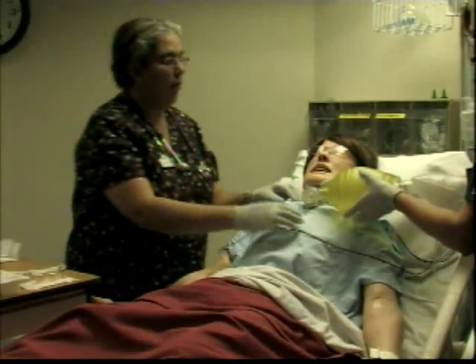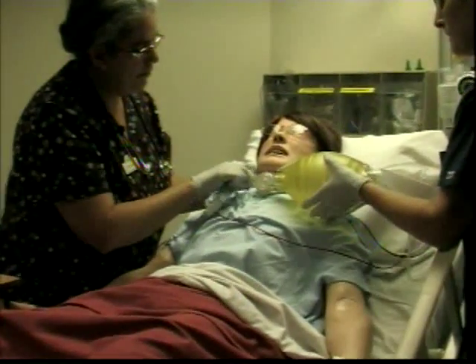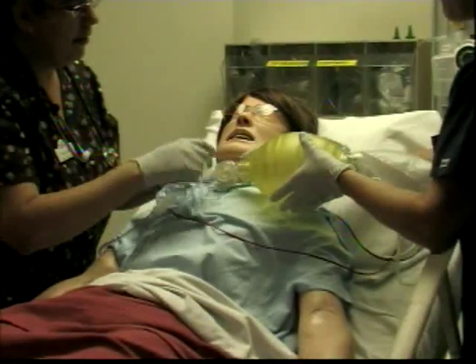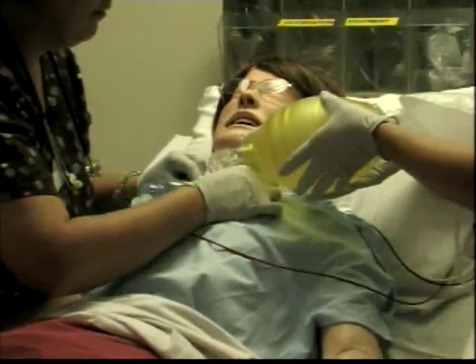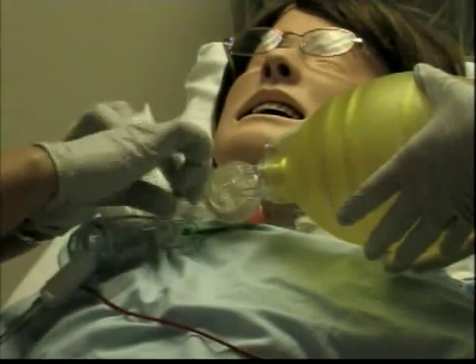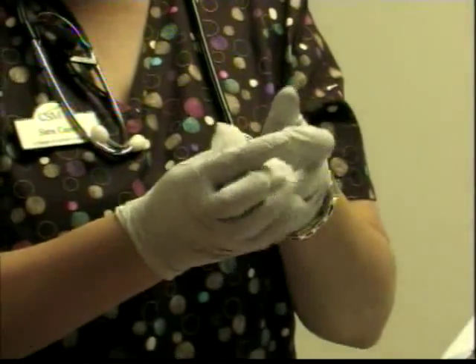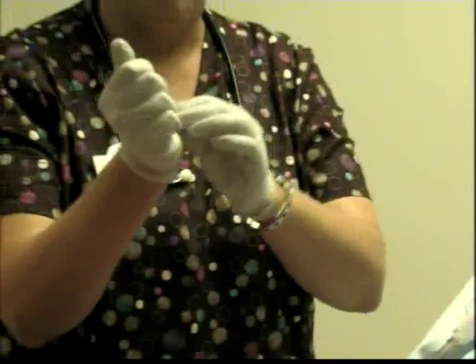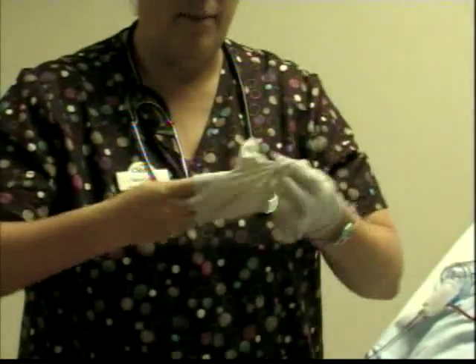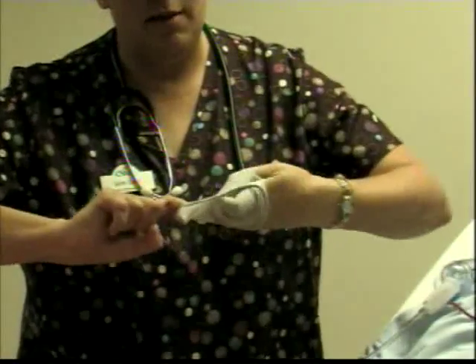Okay? So I will look, and I will take this split gauze, and we're going to take it out. And I'm going to take a look at it. I'm going to look at the secretions: the color, consistency, amount, any odor. And the way we discard, we put it in the palm of our hand, we wrap our glove around it in the other palm, and then we do the same thing we did before, and we put it in the red bag.